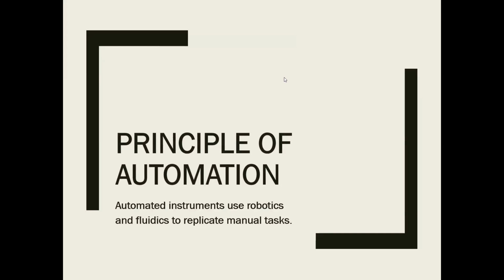Okay? Now, the principle of automation again: automated instruments use robotics and fluidics to replicate manual tasks. But, tatlong but po yun, ha? Huwag po kayong matatakot na darating yung araw, mawawalan po kayo ng trabaho. Kasi I will never. Hindi po yun mangyayari. Machines will not work without the care of medical technologists.